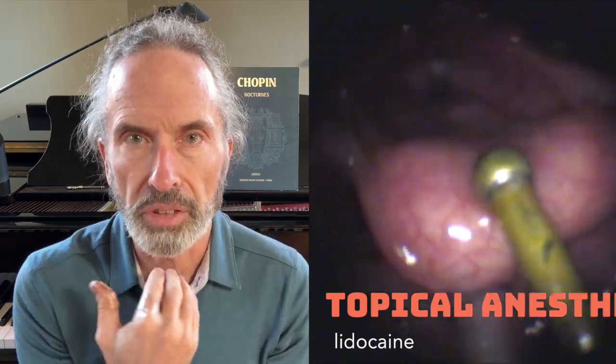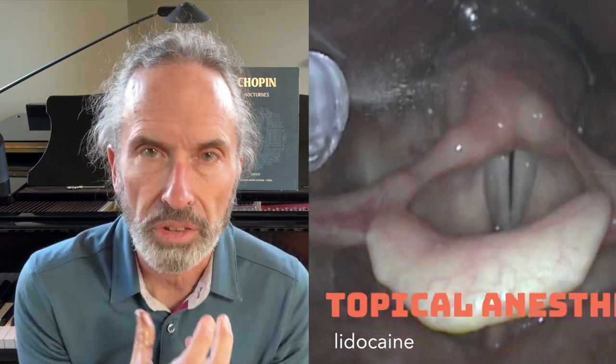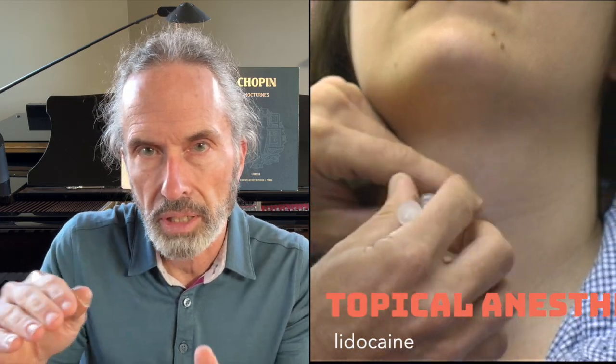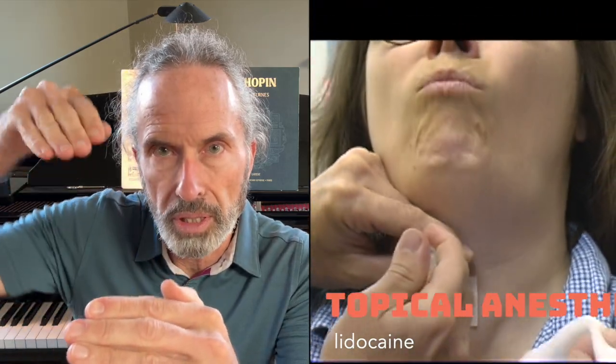The key to this then is to use topical anesthesia on the vocal cords, anesthetize them with lidocaine, and put our camera in. And when we get the endoscope in, we want to go in under the arytenoids, lift them up, and then we can see the vocal processes. Let's take a look at some examples.